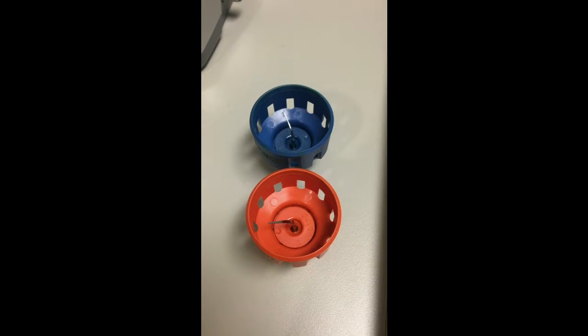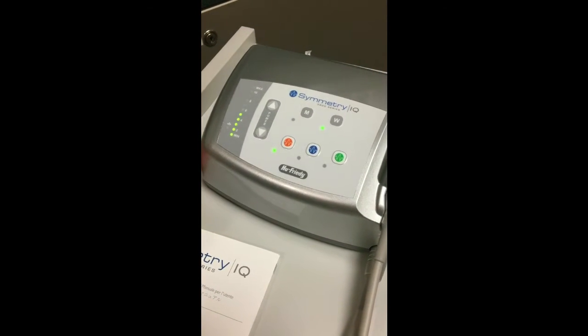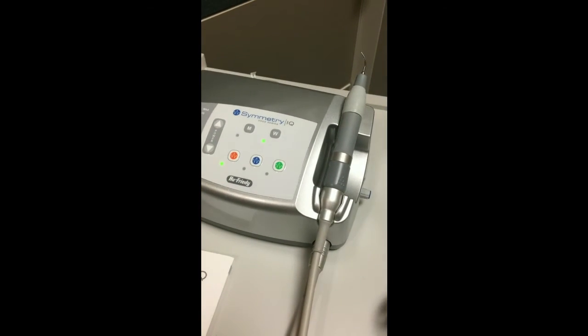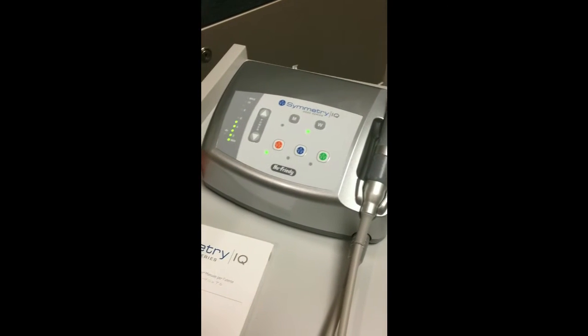The frequency range used for the piezoelectric ultrasonic scaler ranges between 25,000 to 50,000 cycles per second in order to convert a high-frequency electrical current into mechanical vibrations.